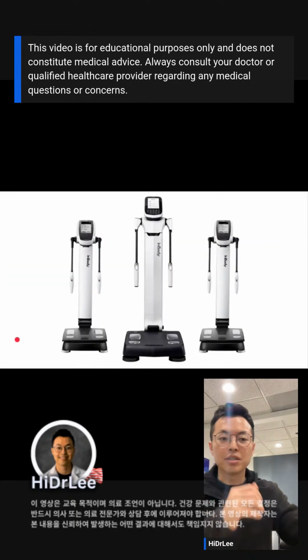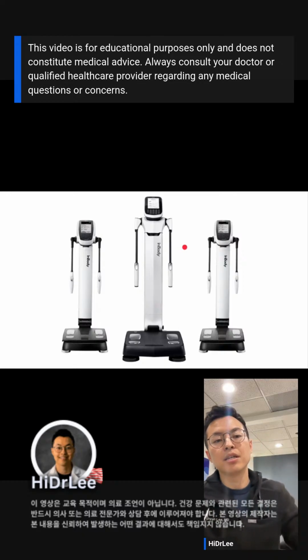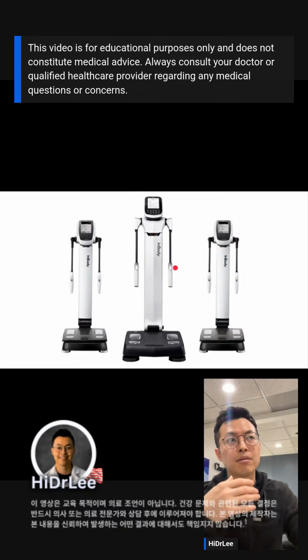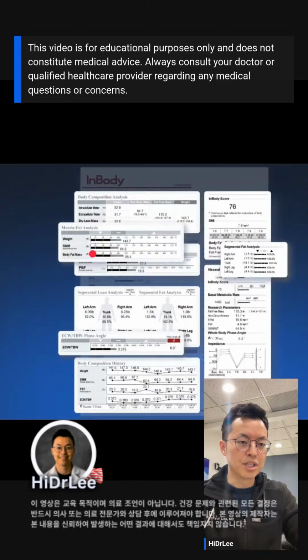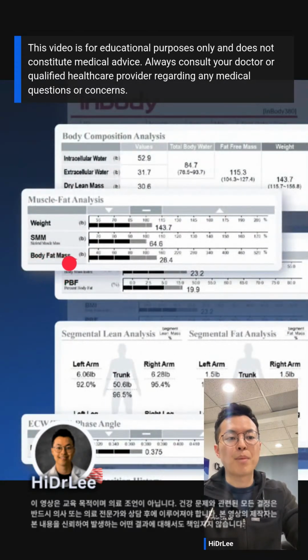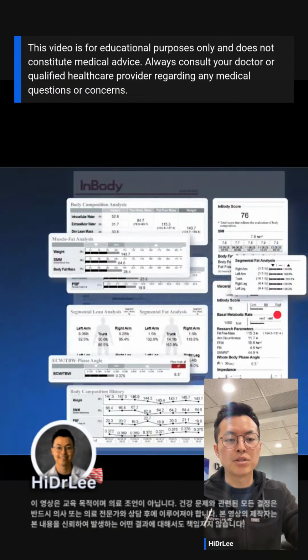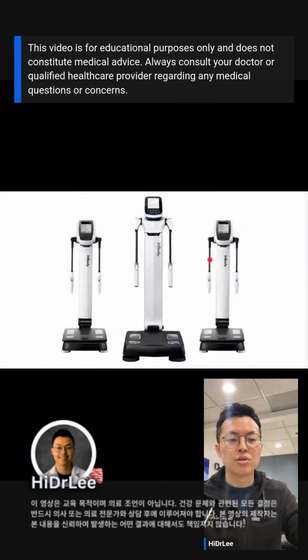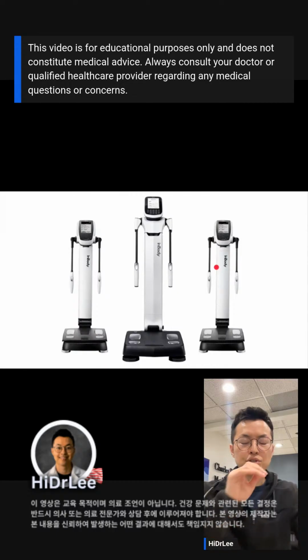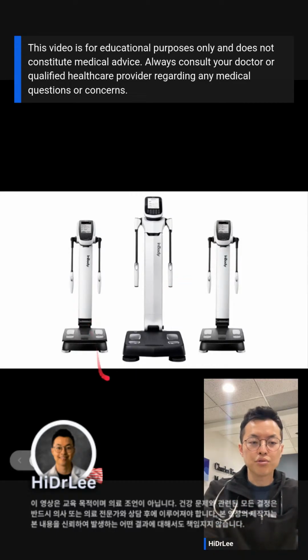And next one is InBody. InBody is a tool that measures many things. You can see that it measures body fat mass, skeletal muscle, body fat percentage, and also basal metabolic rate and visceral fat as well. There are many different types of InBody machines, and we have two of them.